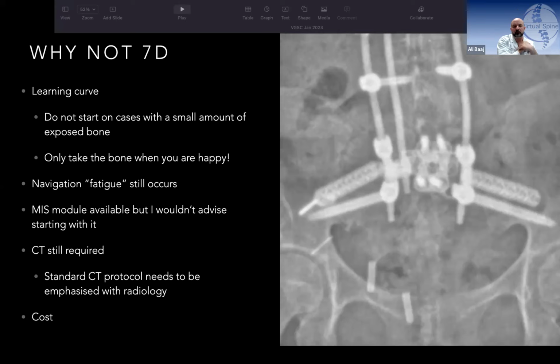But Mike, like the navigation system. Oh yeah, Ali, go for it. Apologies, sorry to interrupt. Just a quick question, and I think you or certainly Beau can talk about that. When you mentioned reflash, or something was off, you were malleting, you have to reflash. Can you walk us through that? What does that exactly entail? What's that process of reflashing look like?